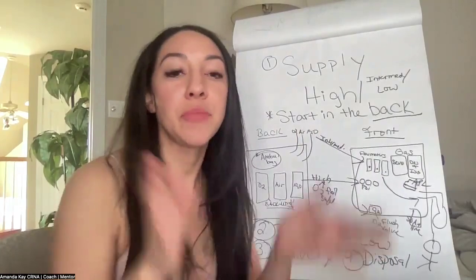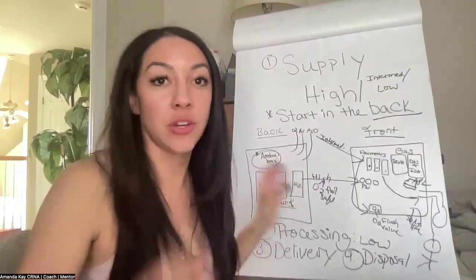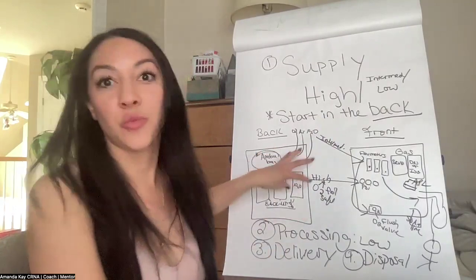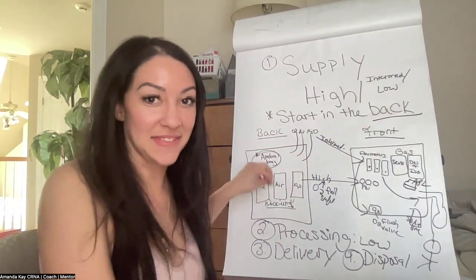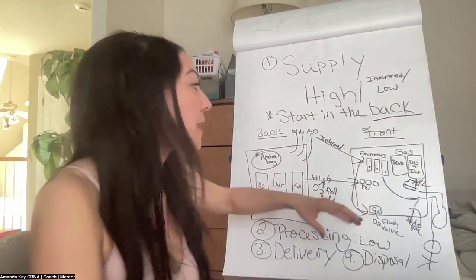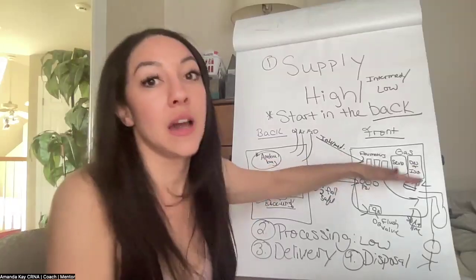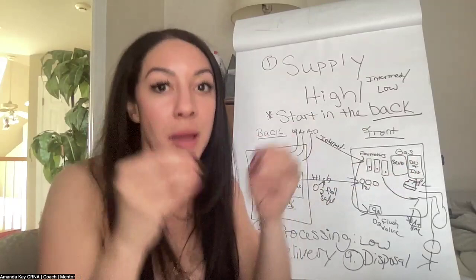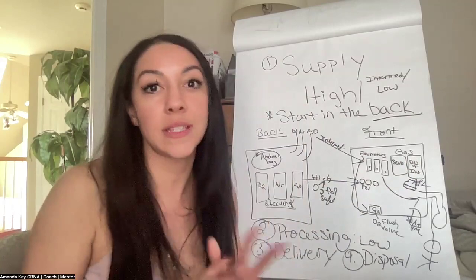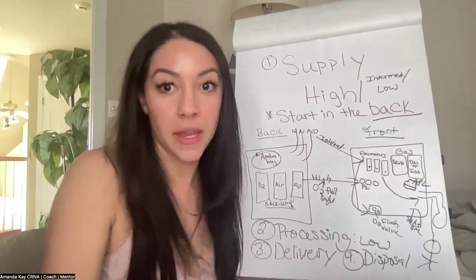Okay. I hope that was nice. Like I said, I'm all about the big picture view. And now you can kind of say, okay, I get the big picture. Now I can go in and review the regulators and cylinders and all those fancy things that are in there, right? Because I understand that that's part of that high pressure system and I get why, because we make sure nothing is spilling into the other. Looking at your flow meters more closely, understanding your gases, just take it piece by piece. You have the big picture now. Now you can break it down and look at the nitty gritty stuff. I always say that: zoom out and then zoom in, and it's going to be less overwhelming for you.